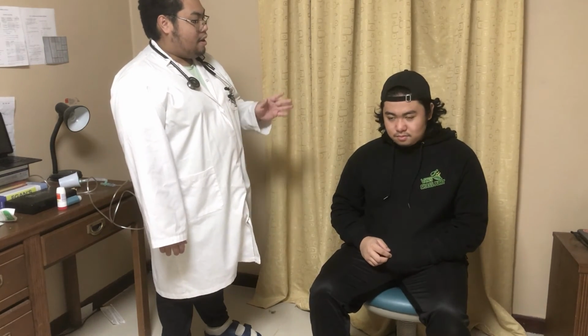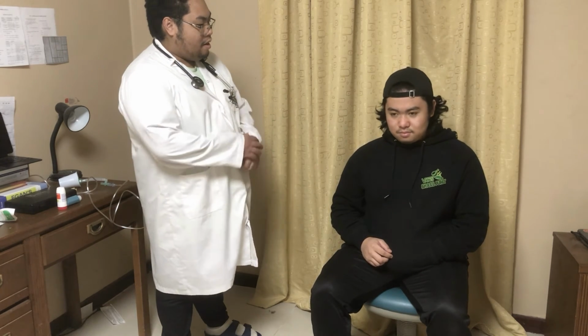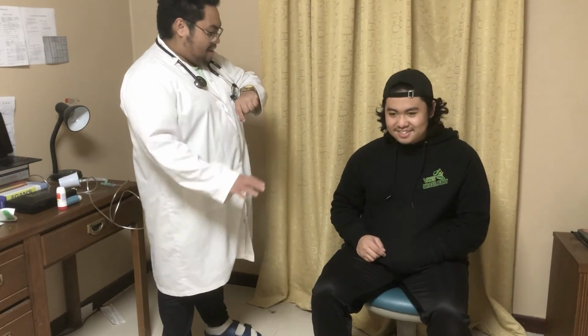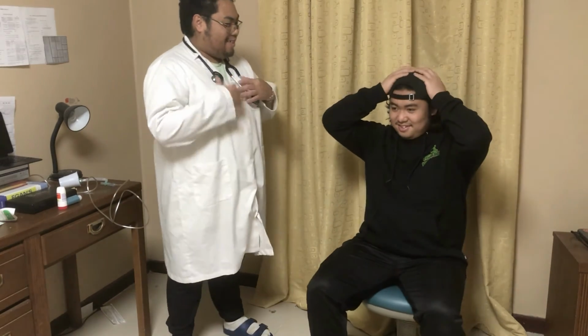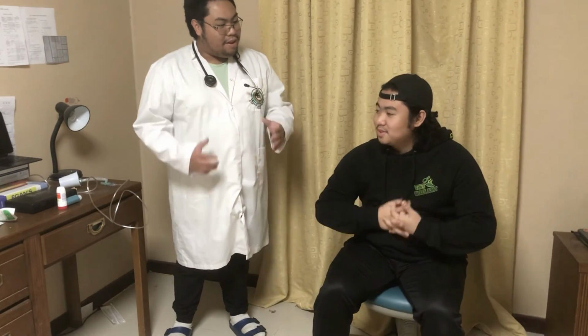So sir, inhale, exhale. Inhale, exhale. Inhale, exhale. Okay, sir, that's good. How are you feeling, sir? Are you feeling alright? Okay. If we can do this now, can you give more effort into it when you're inhaling and exhaling? Yeah. Okay.